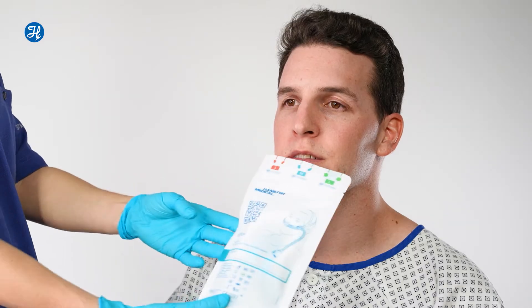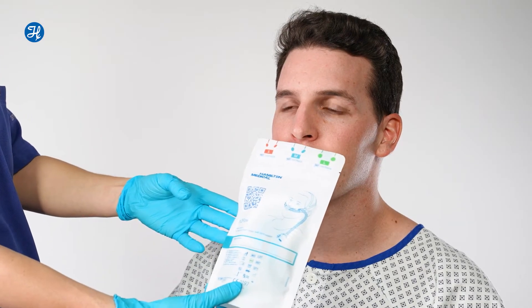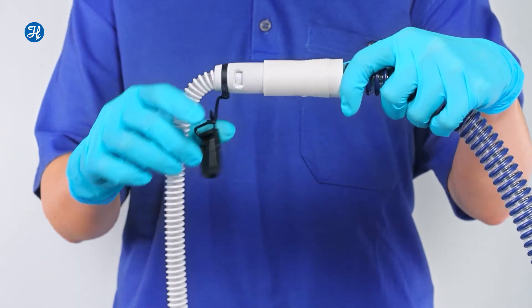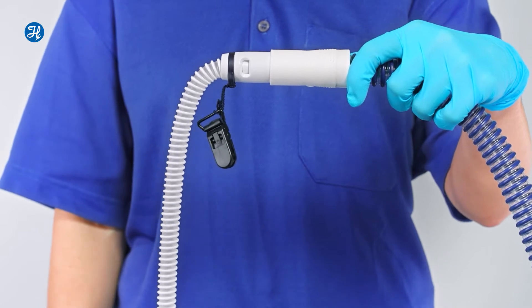The color coding and printed scale for the prongs make it easy to choose the right size. The N2 flow nasal cannulas can be used with either a single limb or a dual limb breathing circuit.